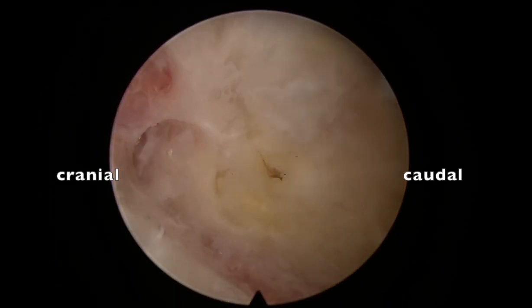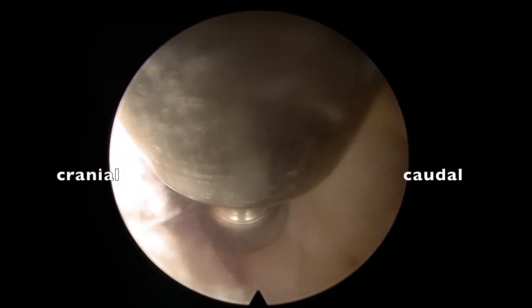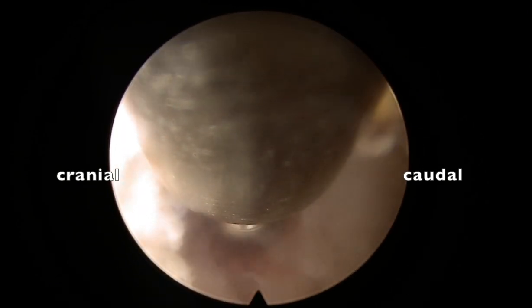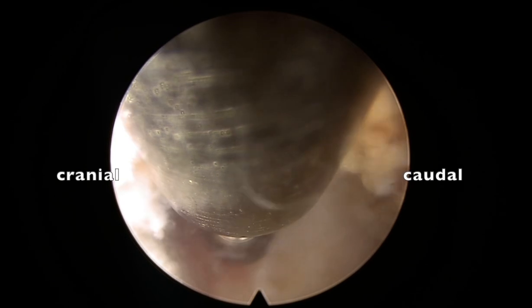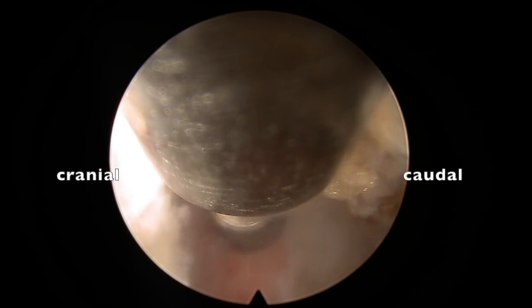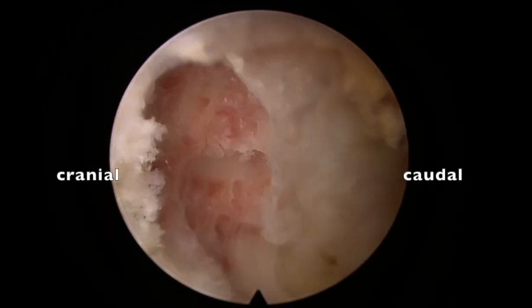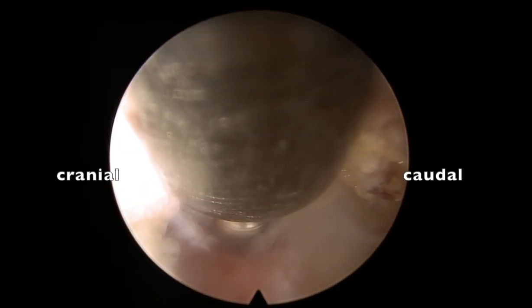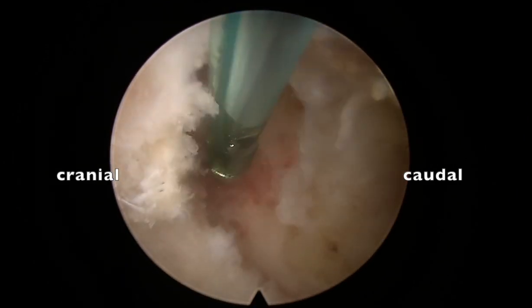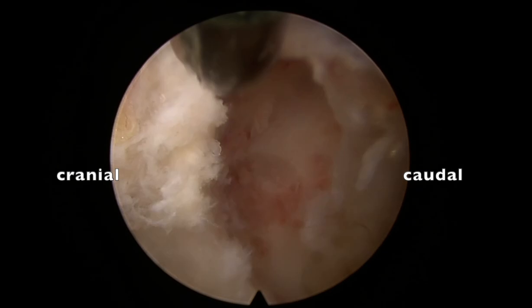Immediately once that is done, go to the lamina and drill the lamina. Here being L4-L5 lateral recess, the interlaminar window is small when compared to L5-S1. We need to drill the lamina a bit more — that has to be kept in mind.